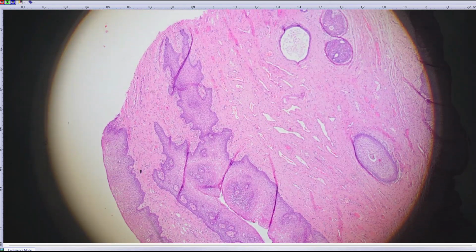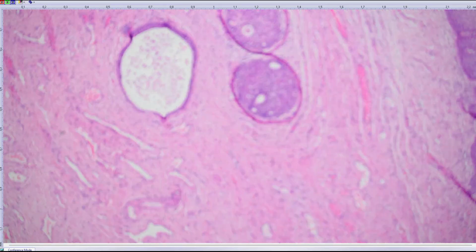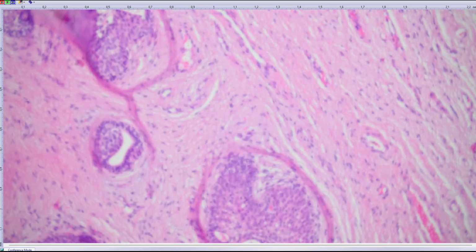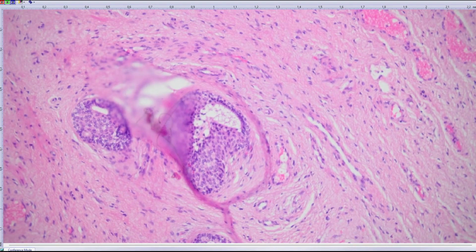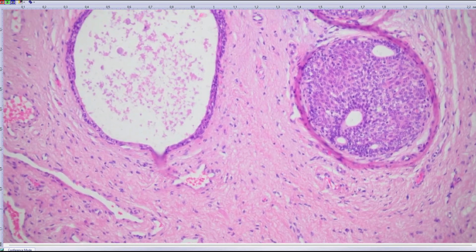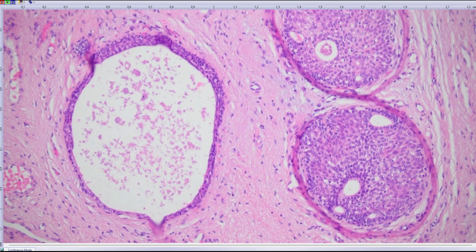It was a polypoid lesion, and diagnostic of that are these squamous-like islands that are fenestrated by adenomatous, benign-looking inclusions, and these inclusions are often prostatic markers positive. In this case, it was not the truth, but actually it is the first case where I didn't find prostatic specific antigen, but it doesn't occur in 100% of the cases.